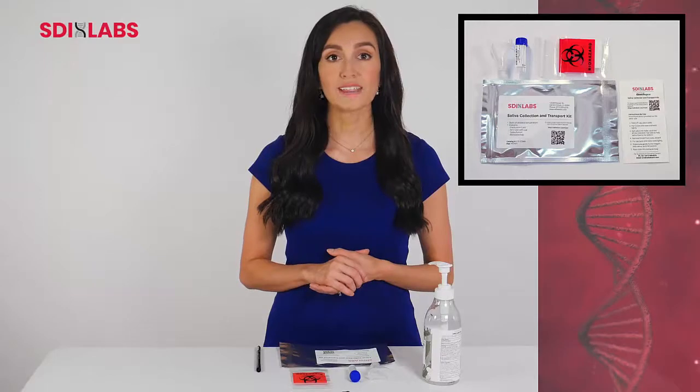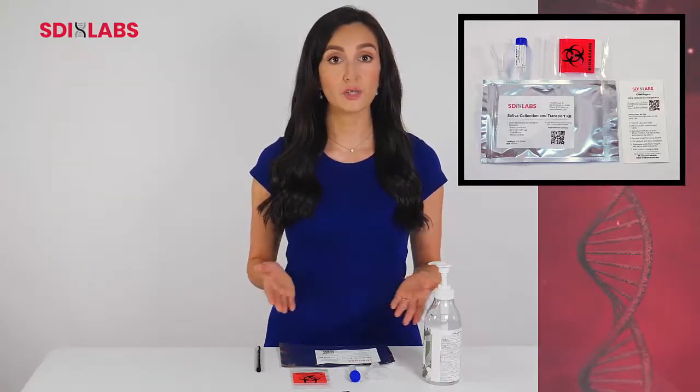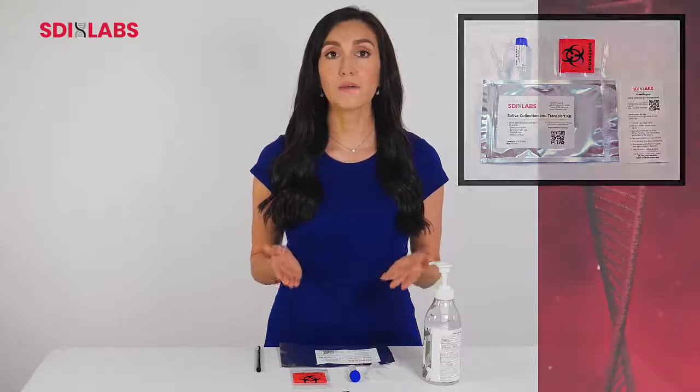When you open your SDI saliva kit, you will find a visual instruction set, a tube, a funnel, and a biohazard bag.